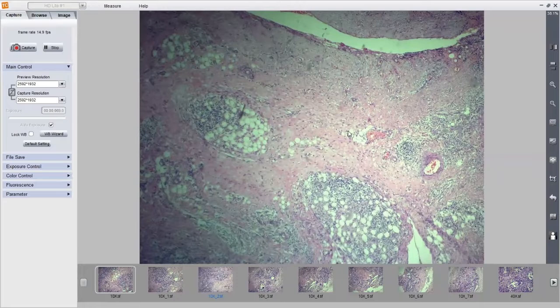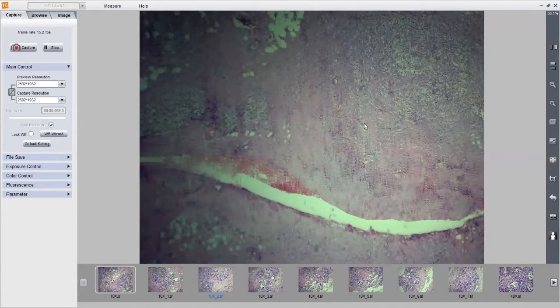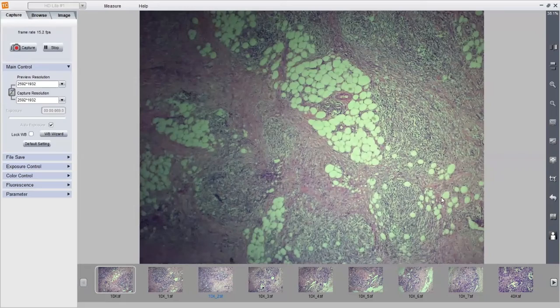Here the majority of the lymph node is sclerotic. If a core biopsy was done from this area and it was a mediastinal mass, then what we would get is only these bands of sclerosis. So I took this another case of nodular sclerosis where the sclerosis is very prominent, and we hardly find some vague nodules within the sclerosis.